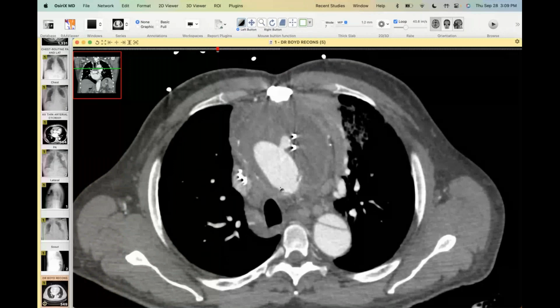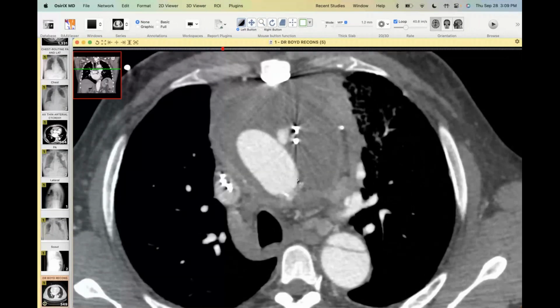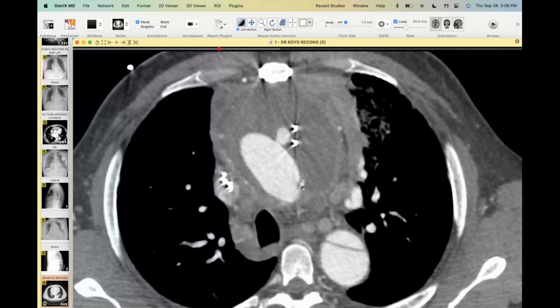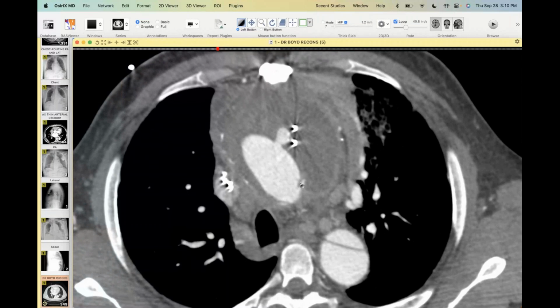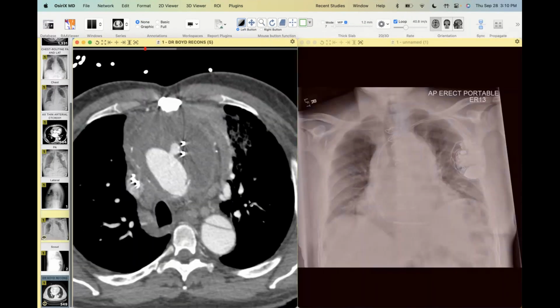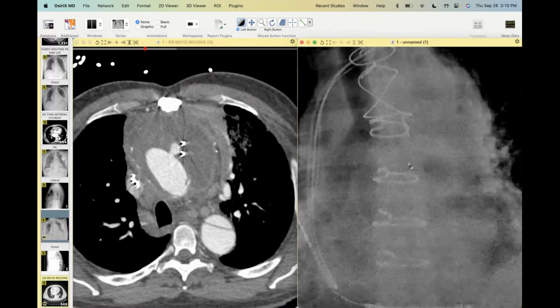Pretty interesting, huh? Crazy, yeah. They don't use those ostial markers much anymore. Our surgeons, some of them still do. I guess it depends on the approach too. If they're doing more minimally invasive, we often don't see them as much. I thought you just use the CT to find the ostium. Right. But this is a sneaky great finding, a great observation.